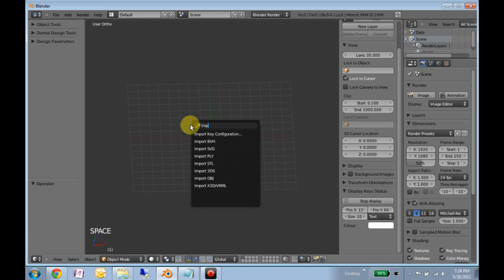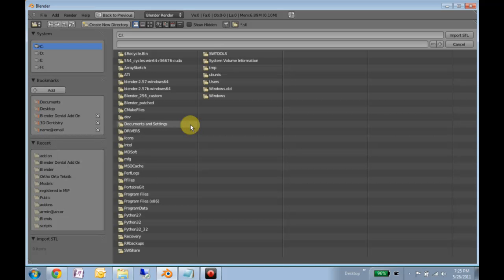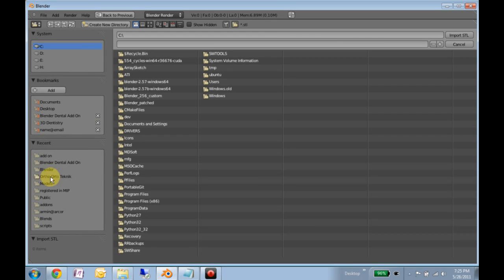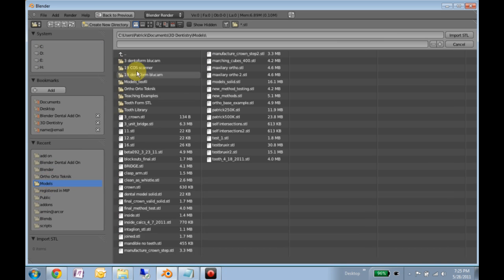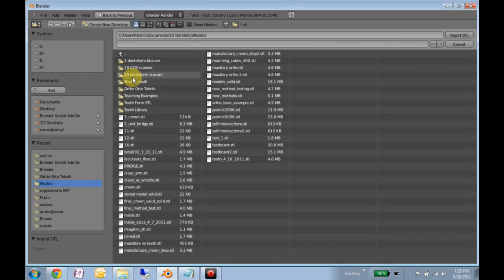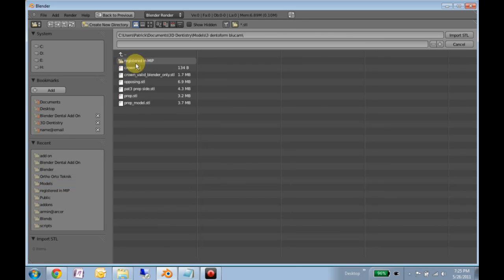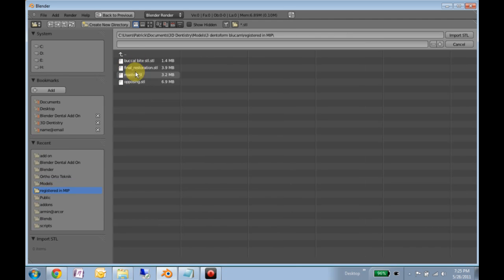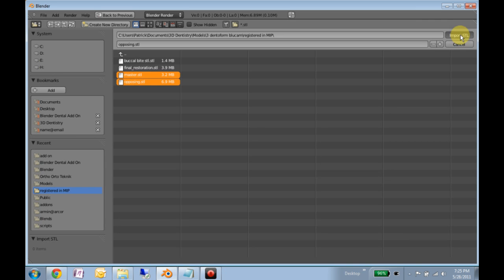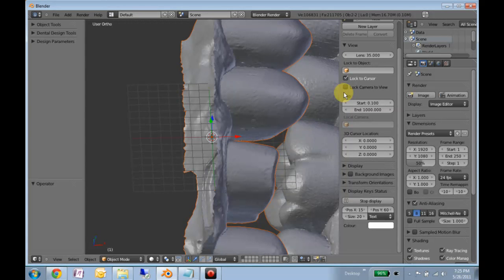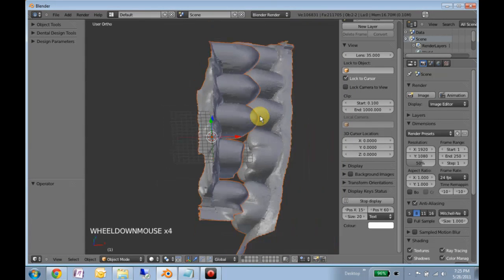So we'll go spacebar, import STL, navigate to where the STLs are. These will be in your Dropbox folder under models, and we will import the STLs. It takes a few minutes, that's nine megabytes. It's got to load it in. It'll be a lot quicker on your computer because you won't be screencasting.